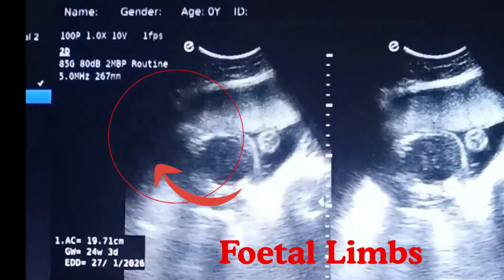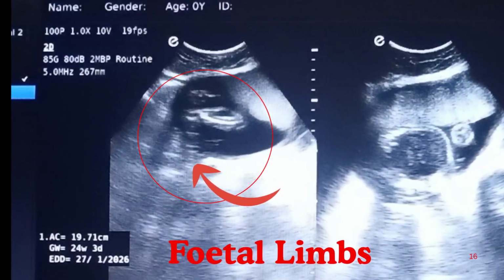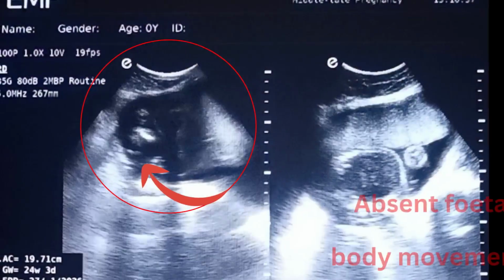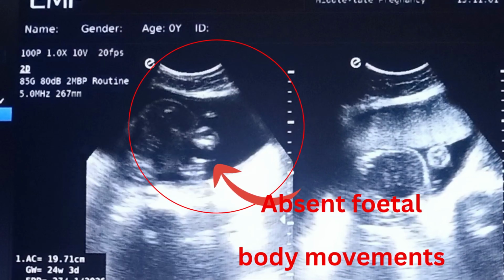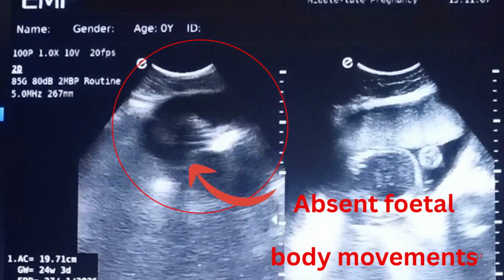As the fetal head is not visualized, we will measure the femur length, FL, to estimate the period of gestation. The femur length is a reliable biometric parameter, especially when the fetal skull or head circumference cannot be assessed. It represents the longest bone in the fetus, and its measurement helps in estimating gestational age and assessing fetal growth accurately. No fetal body movements are observed during the scan.